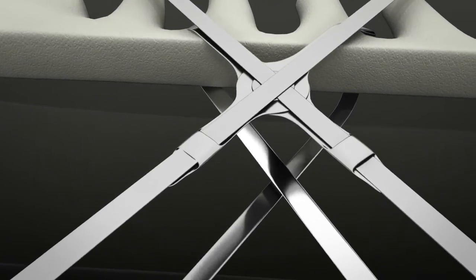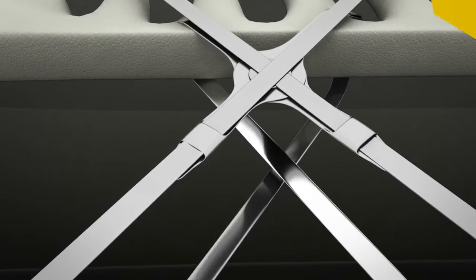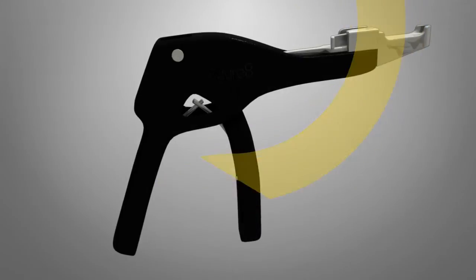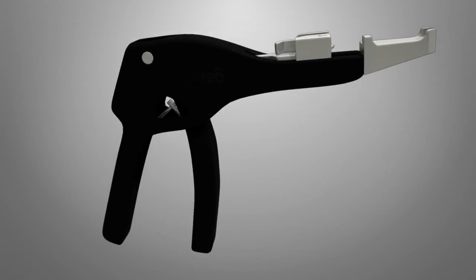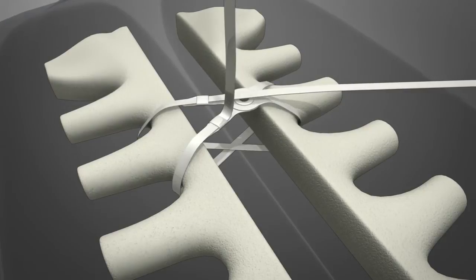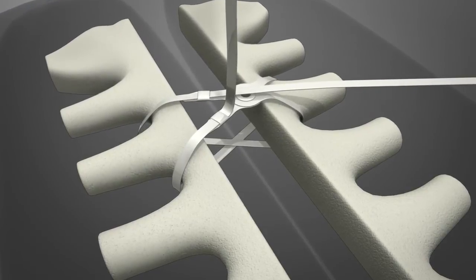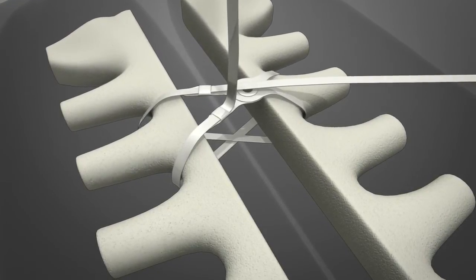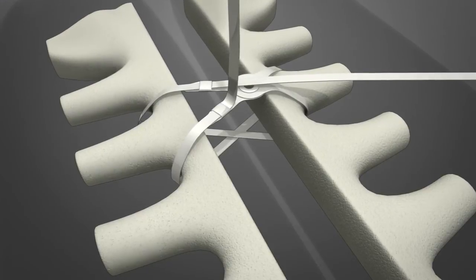Once the straps have been placed in the desired configuration and quantity, they are tightened with the custom Figure 8 tensioning tool. To properly use the tensioning tool, start with the straps at the center of the sternum. The security box is gently pushed down the strap to make room for the tool.